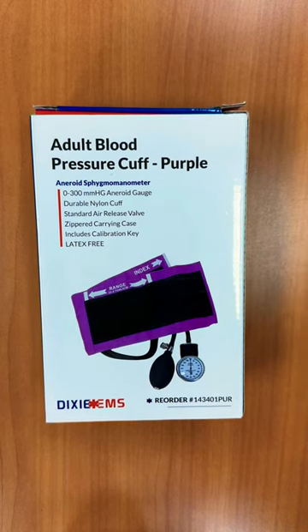This is the Dixie EMS Adult Blood Pressure Cuff. It was purchased through Amazon and it comes in different colors.